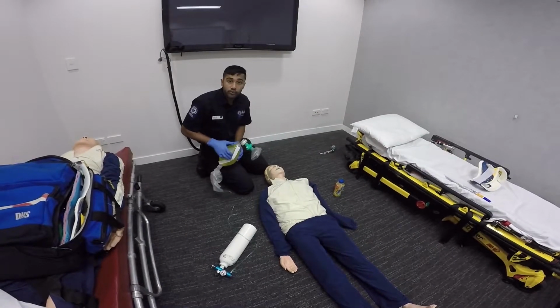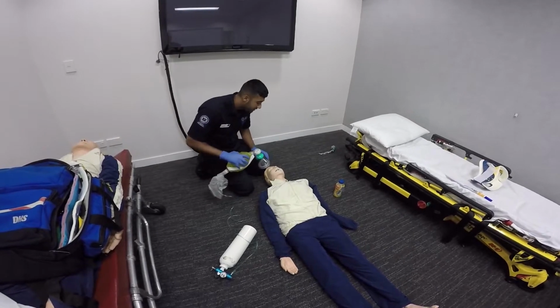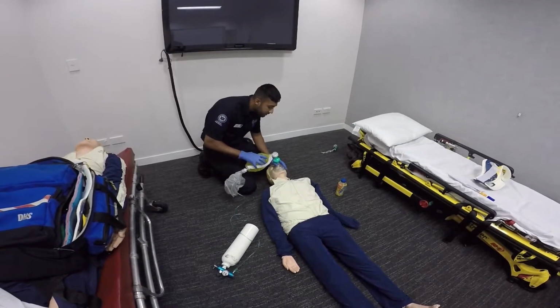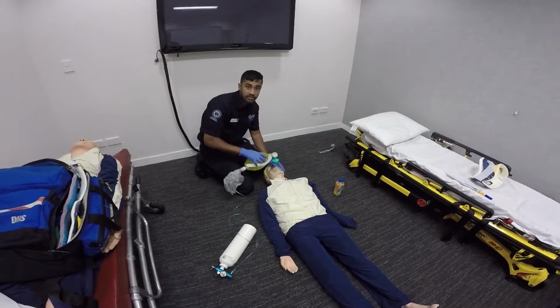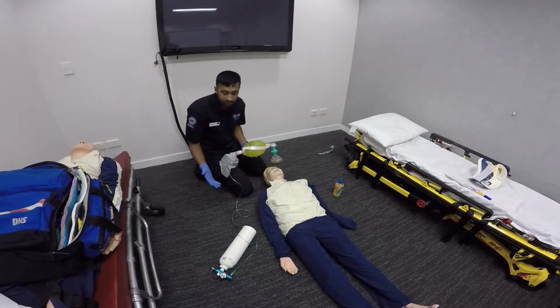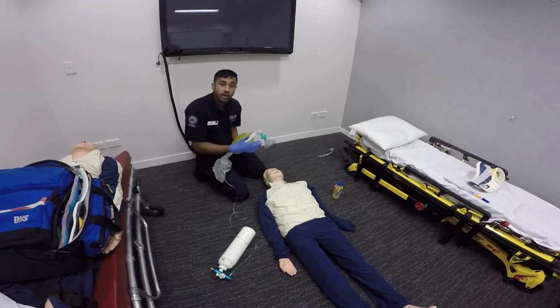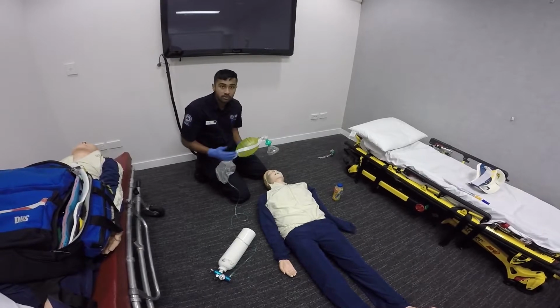So before doing this, it's always good to ask for the patient's consent. So I'm just going to place the bag valve mask over you just to help you with breathing. So I'll ventilate him as needed to. With certain masks, you can actually increase the flow rate, and it's a good idea to always turn the oxygen on before you actually place the mask on the patient.